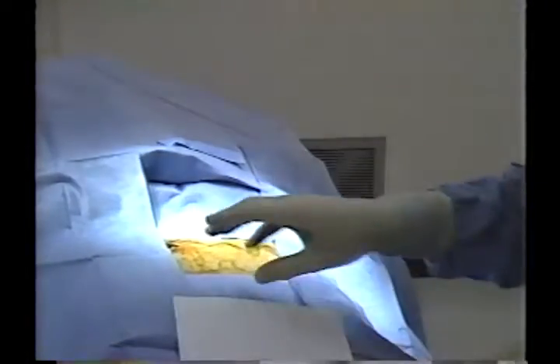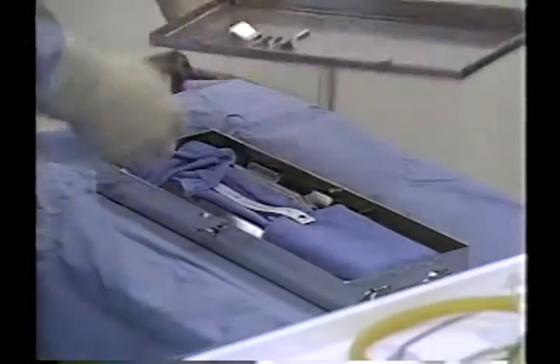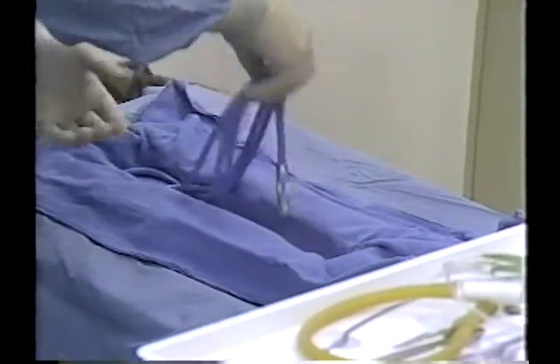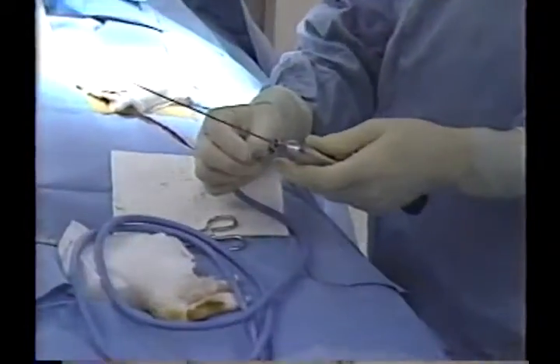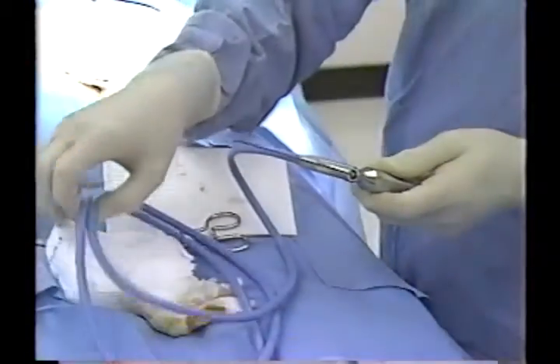A small white drape is used to protect the needle scope eyepiece. The cover is removed from the sterilization tray. The light guide is then removed along with the needle scope and placed on the drape. The light guide is then snapped onto the side port of the needle scope, and instruments are laid out on the drape.